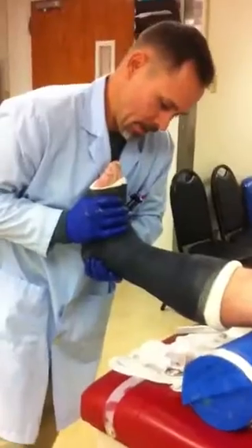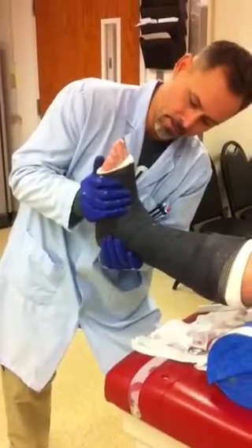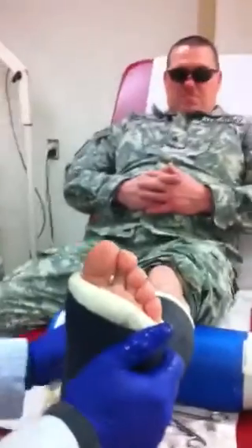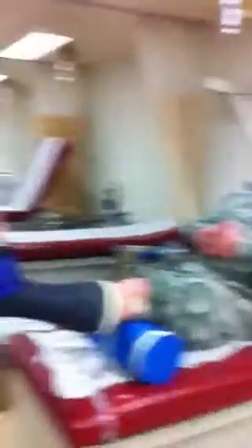Alright, bend your knee. What I do very last is give the ankle one more quick push to make sure it's in the right angle. And so here we have a short-legged, non-weight-bearing cast. It comes to right below the toes as you can see. Ankle is at 90 degrees, it's well padded. Non-weight-bearing means this patient is not supposed to walk on this cast. So what are you going to do? I'm not going to weight-bear on this cast. And you have a knee scooter at home. Thank you to Sergeant Paul Gordon for his participation in this documentary.